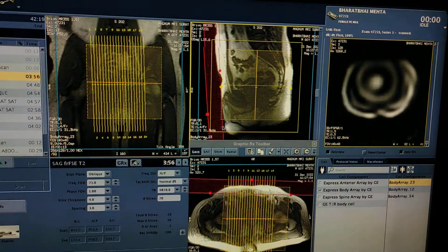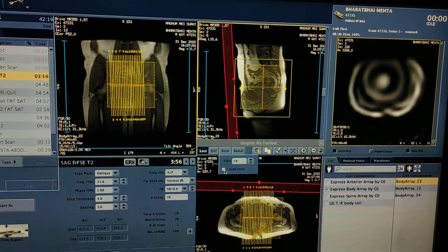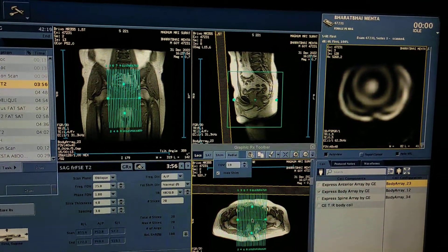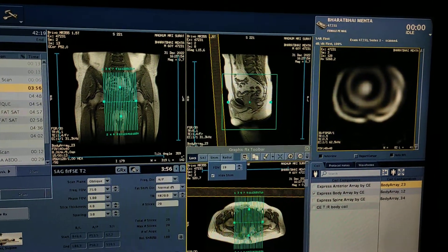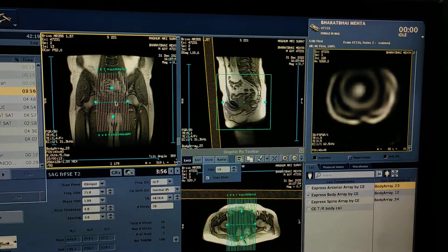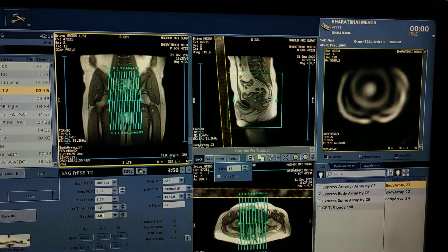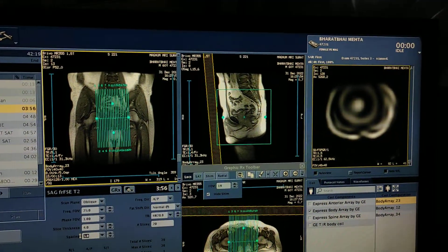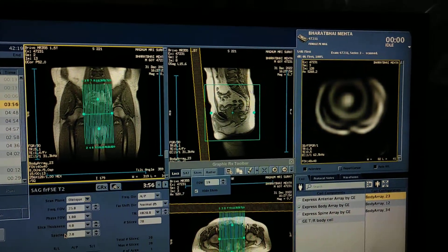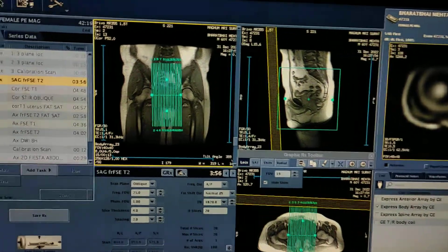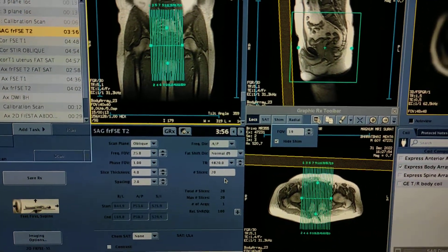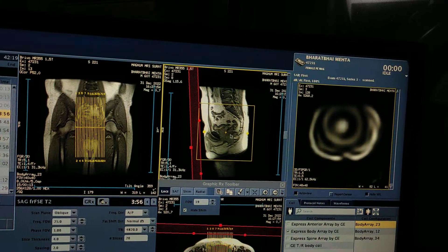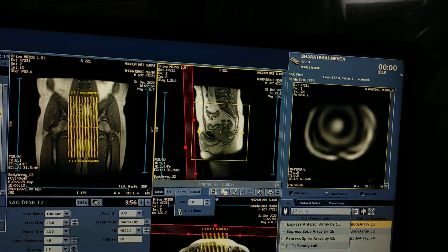Enlarge the image. First of all, adjust your FOV, then tilt or angulate the other sequences. Adjust in coronal and axial. Here it is 4 mm thickness and 3 mm spacing — you can reduce spacing as needed. I am taking 20 images: 4 mm thickness, 3 mm spacing, 20 images. Keep the saturation band anteriorly to reduce artifacts. Click on shim.